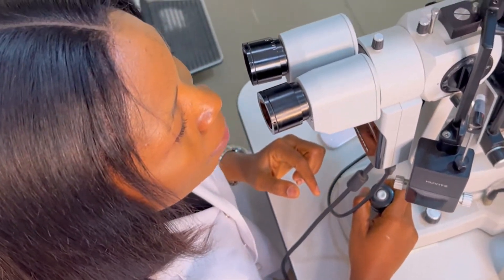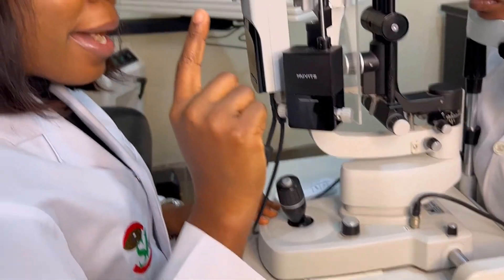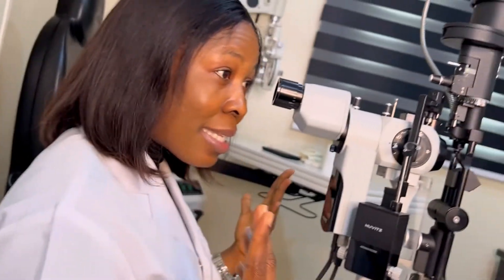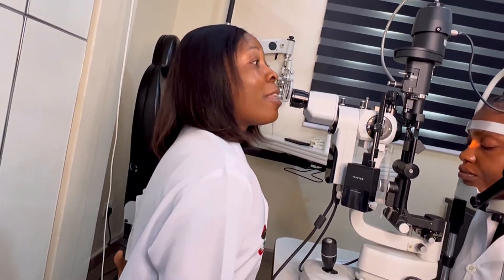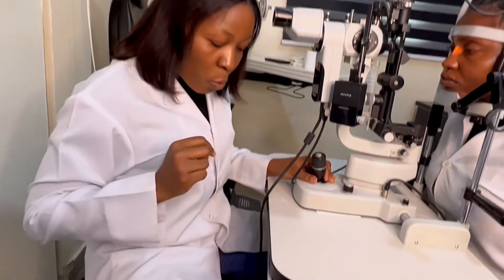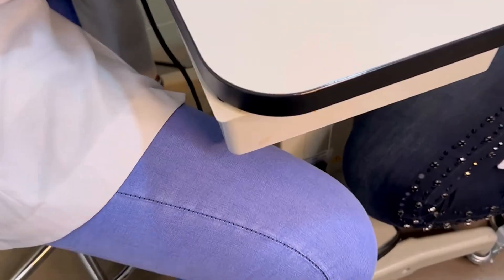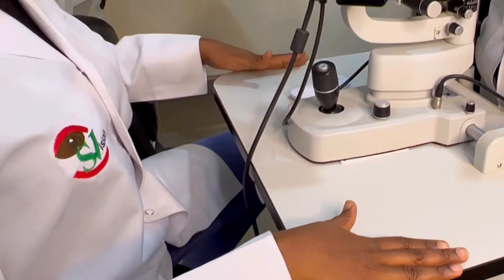After achieving single binocular vision, gradually pull back the instrument, reduce the rheostat to the lowest, and lock the slit-lamp biomicroscope. Remember, you as the clinician should also be comfortably seated with your back straight — make sure your back is not arching. Both clinician and patient should have their backs as straight as possible and be sitting comfortably for the practical. Also, do not forget to lock the table wheels before you start your practical — this enhances stability of the table so it cannot move. Make sure everything needed to maintain stability — the seats and the table wheels — are all in order.